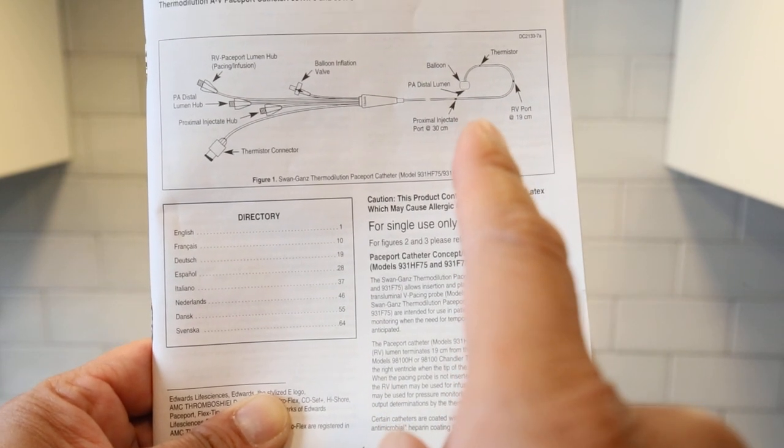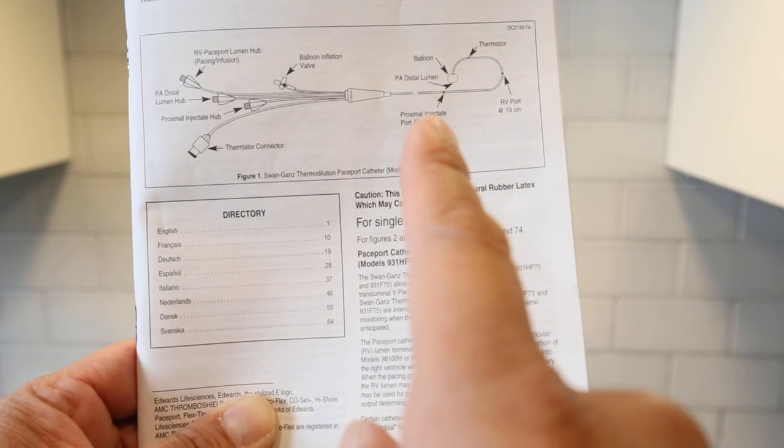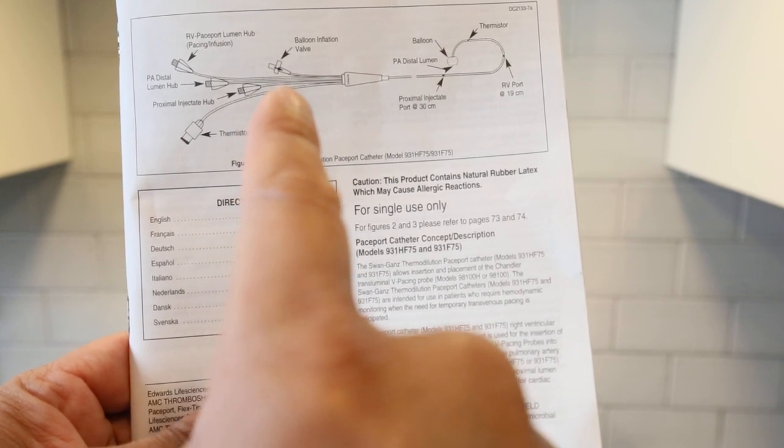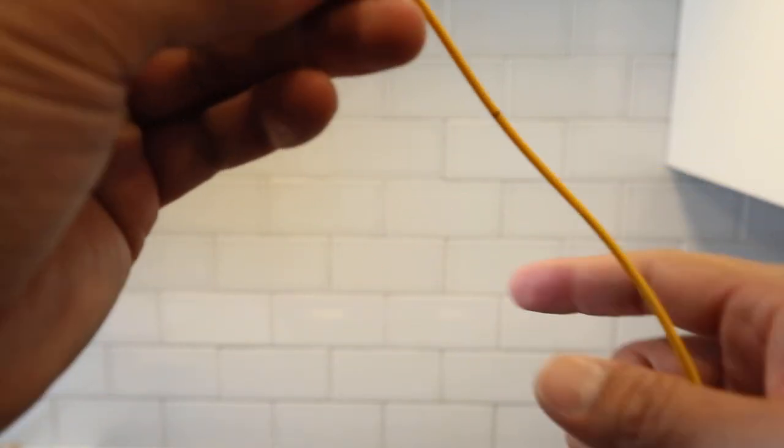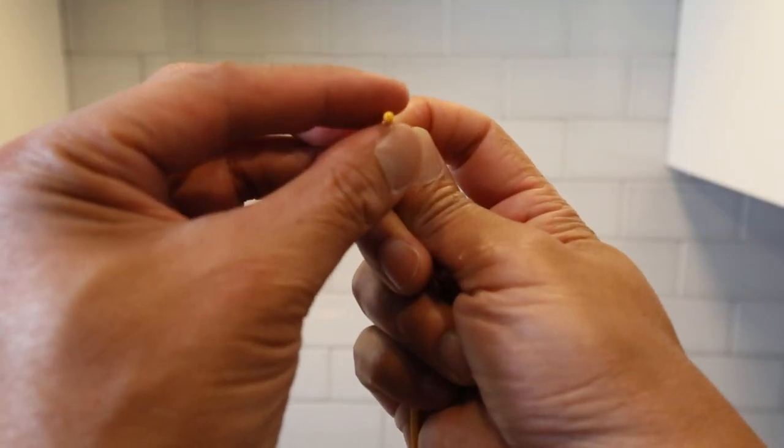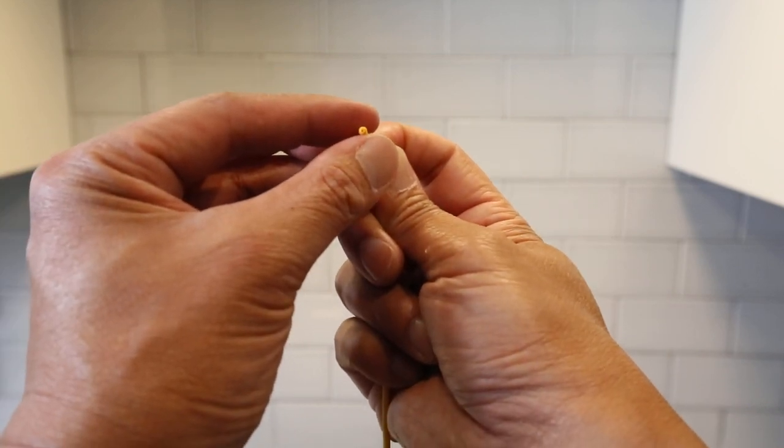Okay, so the distal is at the very end. The RV port and the proximal. Let me check. The proximal goes with the shortest one, so it's closest to you. And you got your distal most distal port, which is that hole right there.